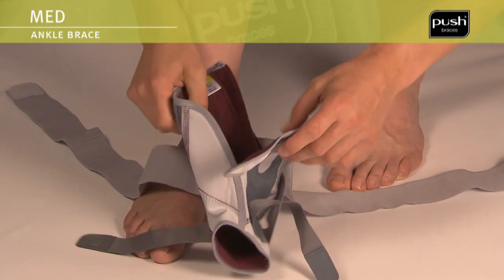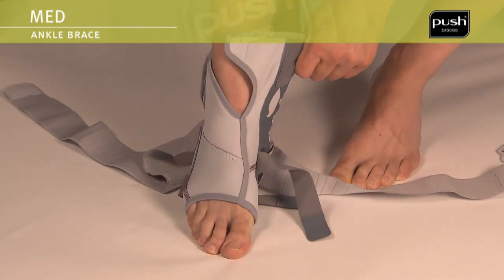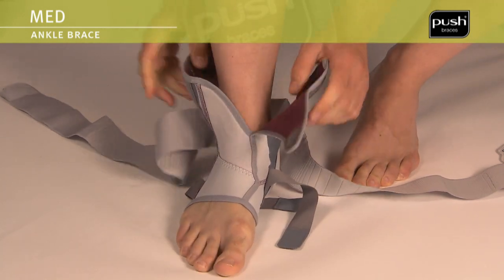Slide the base around your foot, making sure it fits snugly. Keep the foot at an angle of 90 degrees in relation to the lower leg.